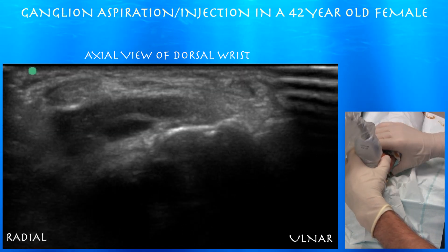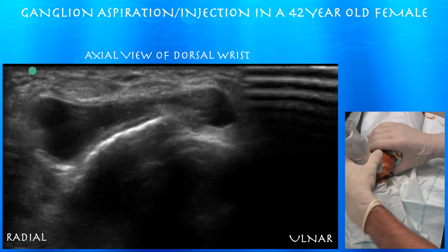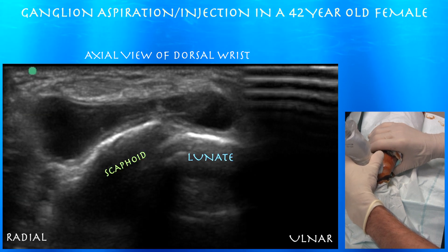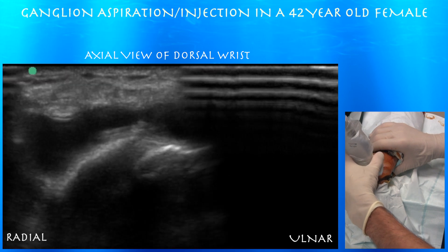As you go a little bit distal, you can see the extent of the cyst. It's pretty big — like a dumbbell actually, or like one of those little doggie bones, running under the tendons.